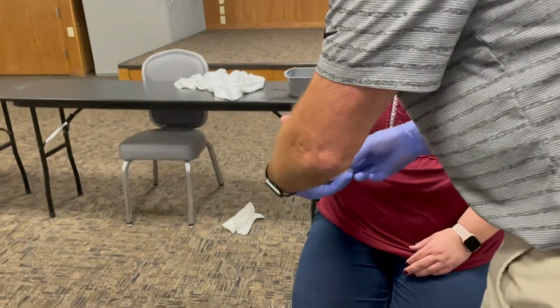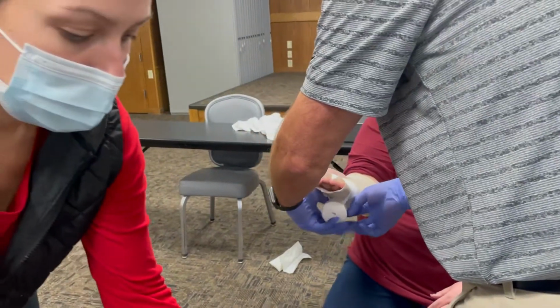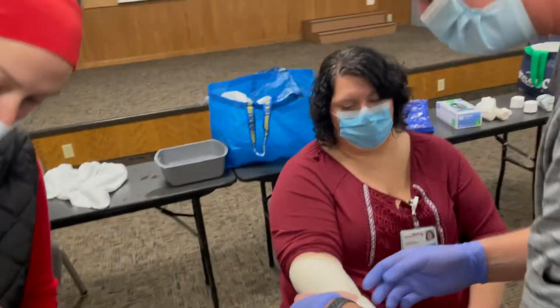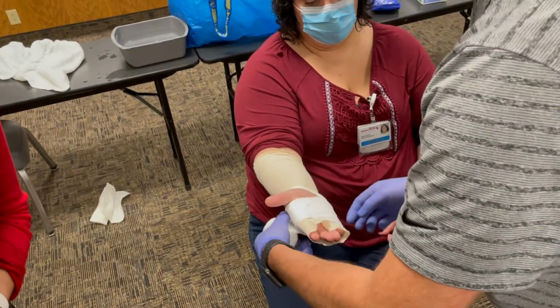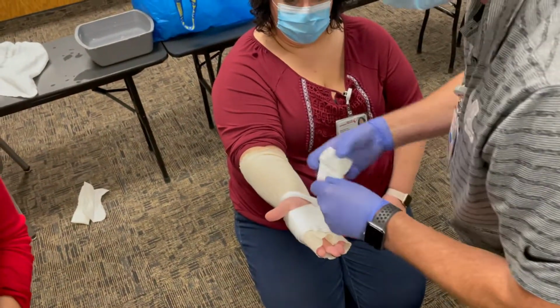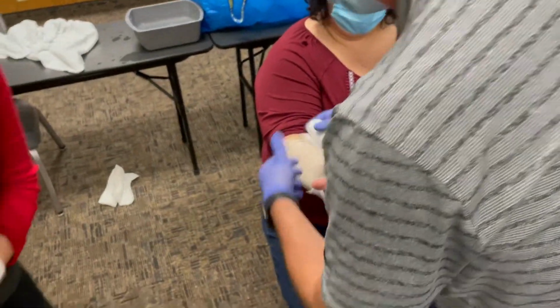And the Webril kind of stops at that crease. So you can go past it a little bit, just so you can roll it back and make a nice, comfortable splint. And this is 2-inch I'm using here. And with the distal radius fracture, you kind of want to pad their radius too, because they're going to be sore there.